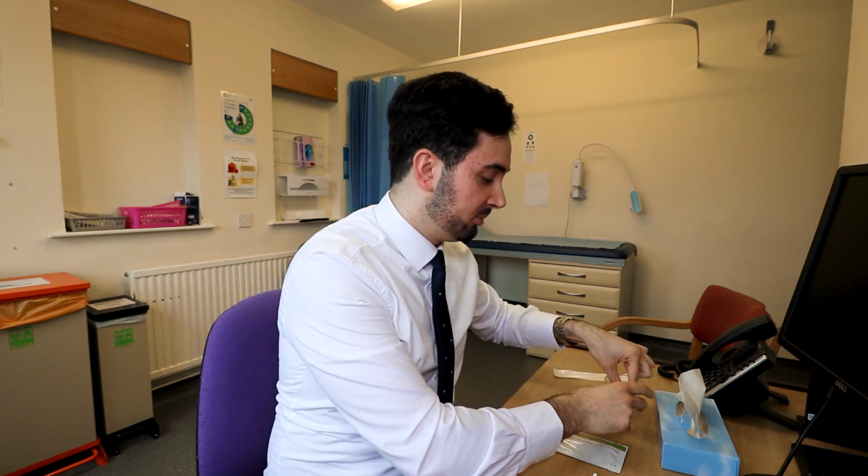So once you've done your 6, pop it back in your little cup thing to hold it upright so it doesn't spill out, and close the lid of your extraction solution. Easy as that. But remember, like I said, the testing kits do differ, so please read up that information leaflet.